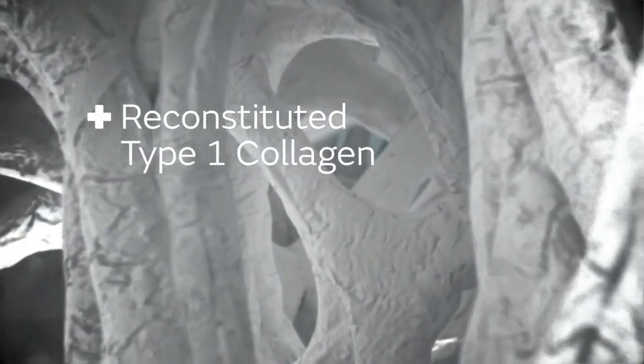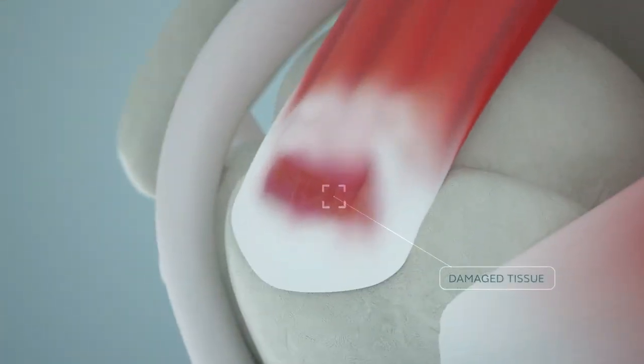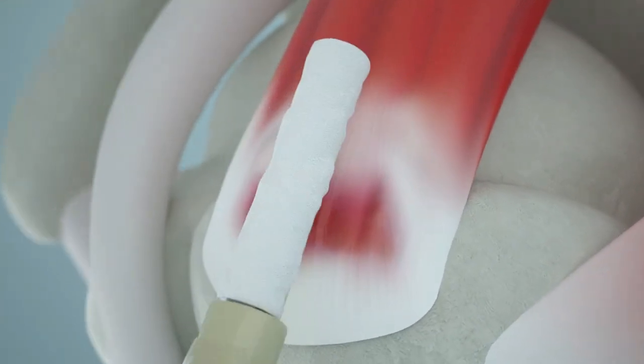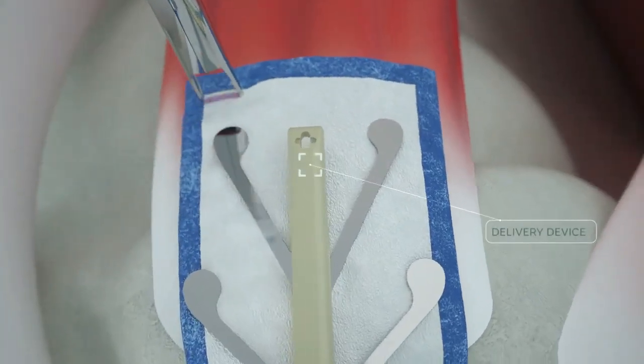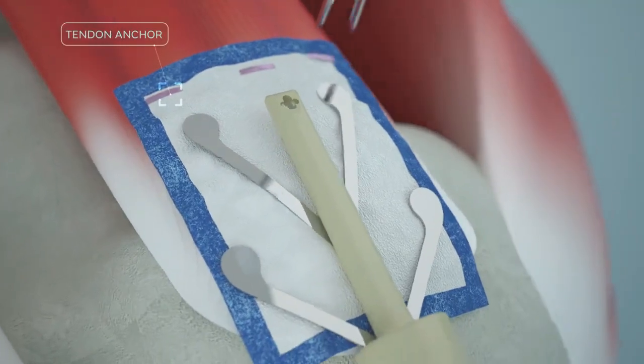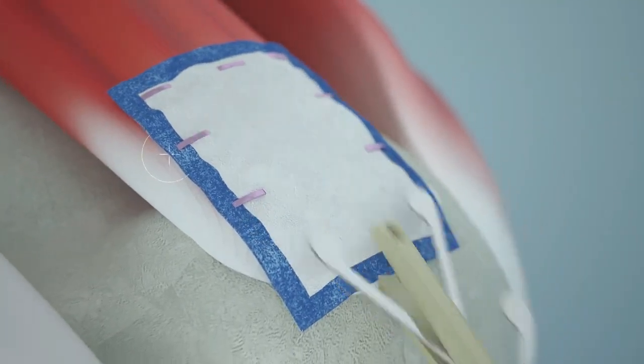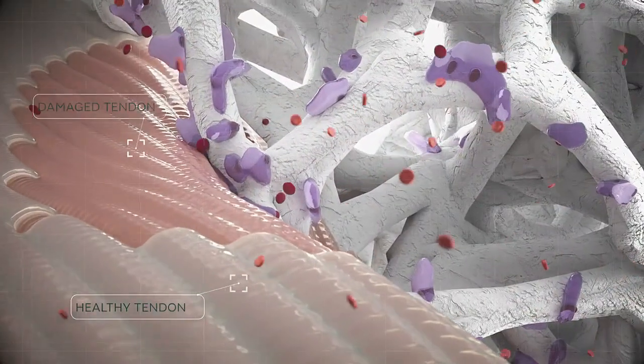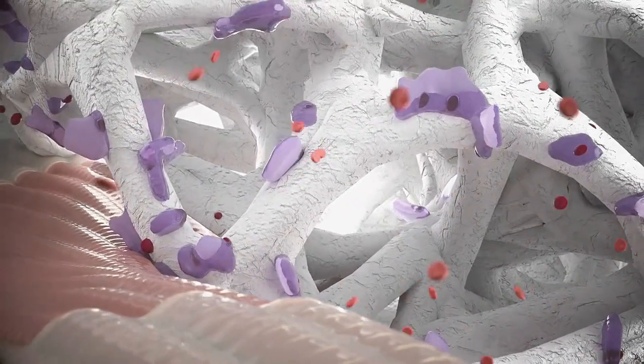It is a porous matrix of type 1 bovine collagen delivered from the lateral portal, covering the damaged tissue. We can use tendon anchors to fix it on the tendon and bone anchors to fix it on bone.